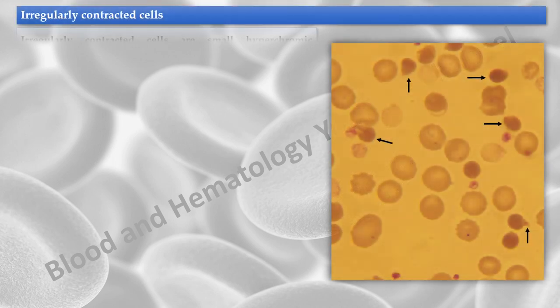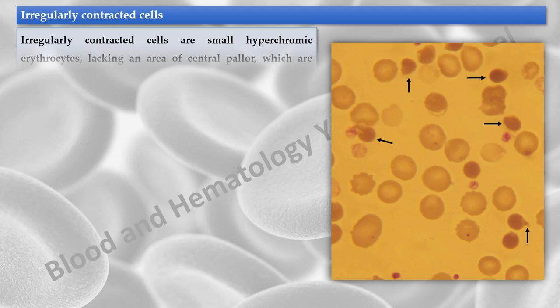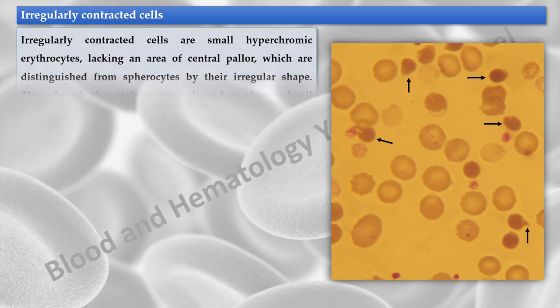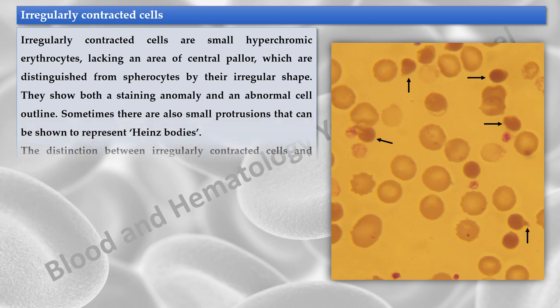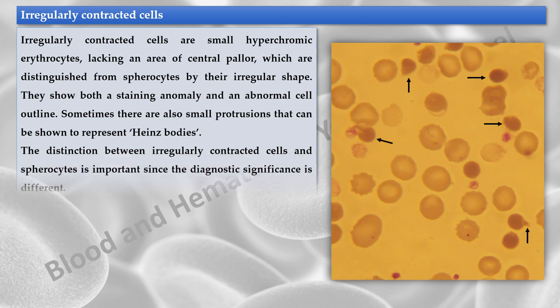Irregularly contracted cells are small hyperchromic erythrocytes lacking an area of central pallor, which are distinguished from spherocytes by their irregular shape. They show both a staining anomaly and an abnormal cell outline. Sometimes there are also small protrusions that can be shown to represent Heinz bodies. The distinction between irregularly contracted cells and spherocytes is important, since the diagnostic significance is different.